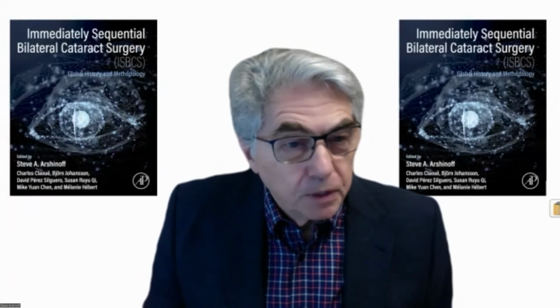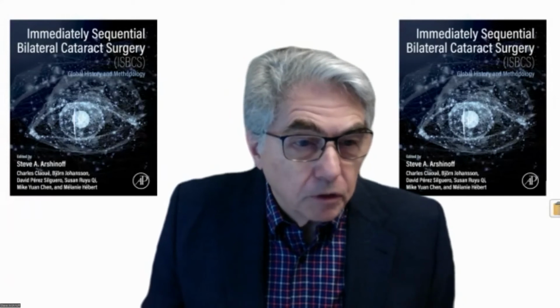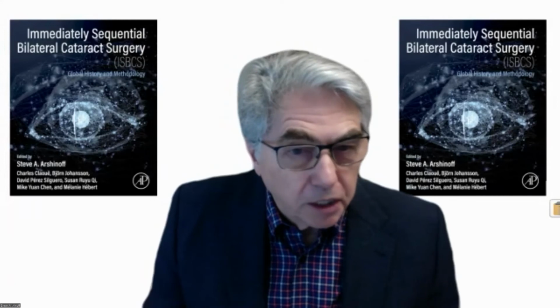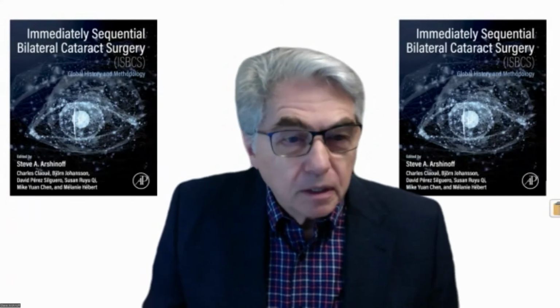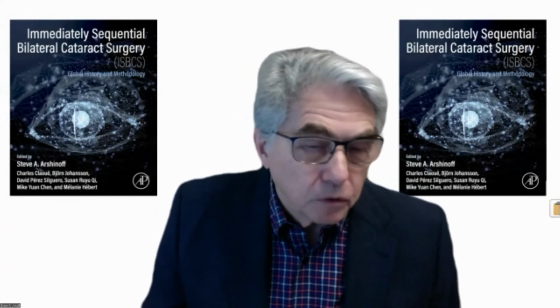If you want to put in a phakic lens, often HPMC can be the best OVD, because you don't need a lot of pressure. You can just slide it in gently, and it comes out easily without shaking of the lens. So taking it off the market is a bit severe, but I think you don't really want to use it for your more severe cataract cases, or really for most cataract cases. So I think it's a drastic statement that HPMC should be off the market.